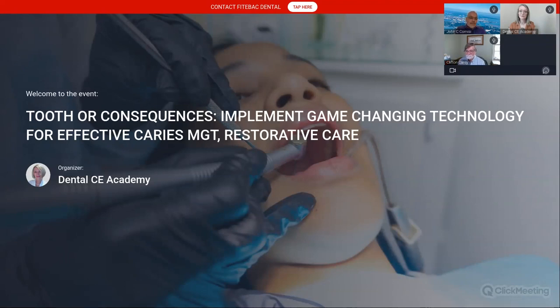But incorporating the K21, you're going to do two things. You're going to reduce the bacterial content, you're going to clean the tooth, and you're going to enhance your bond strength. So basically, from a restorative doctor's point of view, that's the way I would go personally. Before I would go all the way away from silver diamine fluoride, the question is, any thoughts on SDF as a caries arresting agent? It certainly does work. And our university uses it appropriately, but not everywhere.